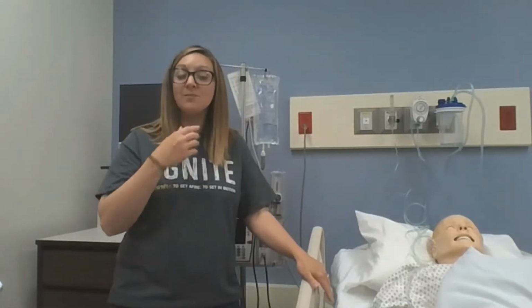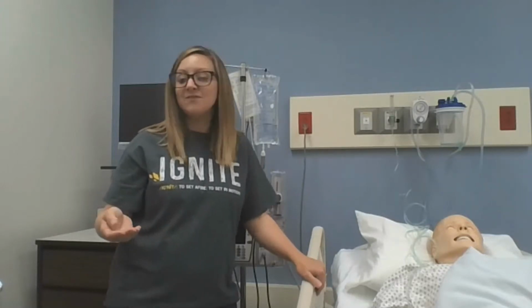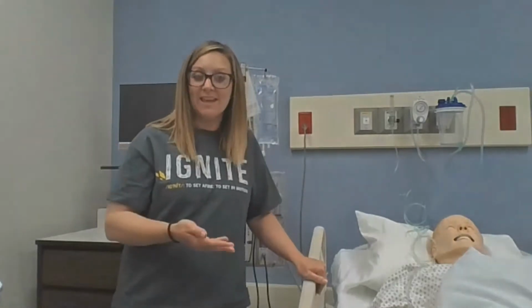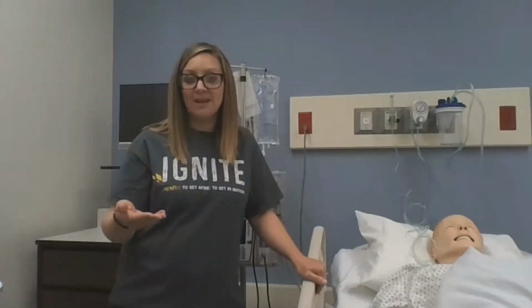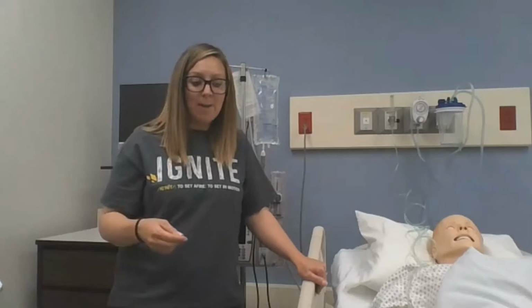Generally speaking, reasons to not use the PCA would be patients that in post-op cases really need to ambulate pretty frequently. It's often a frustration to have to do hourly pain medication for patients, but one of the things that our surgeons like is that it requires the nurse to come in and assess the patient that often. If you're going to go and give IV morphine every hour, you're having to lay your eyeballs on the patient and make a nursing judgment over whether or not it's appropriate to administer that narcotic. So you're seeing them and making sure that it's safe to administer the narcotic, which is one reason that maybe they wouldn't use a PCA pump.